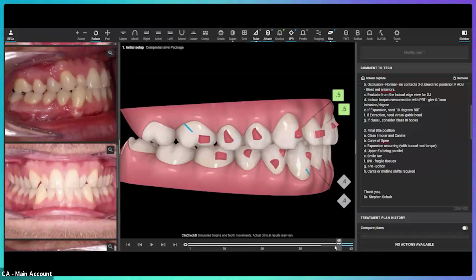Now, in reality, is the jaw going to be moved backwards? Theoretically, you could force it back if you use really, really heavy elastics. You could force the lower jaw back and put pressure on the retrodiscal tissue and cause TMD. So you don't use heavy elastics when doing class 3.